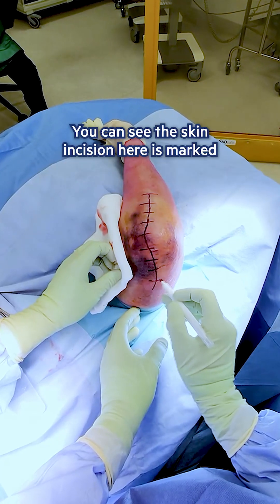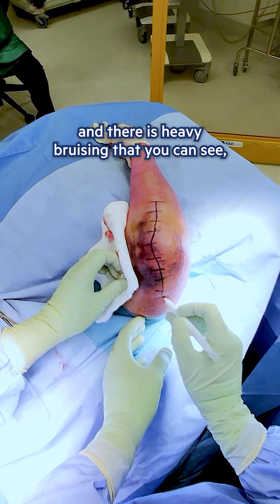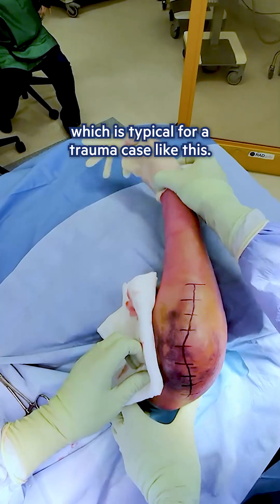This is how the patient is set up. You can see the skin incision here is marked, and there is heavy bruising, which is typical for a trauma case like this.